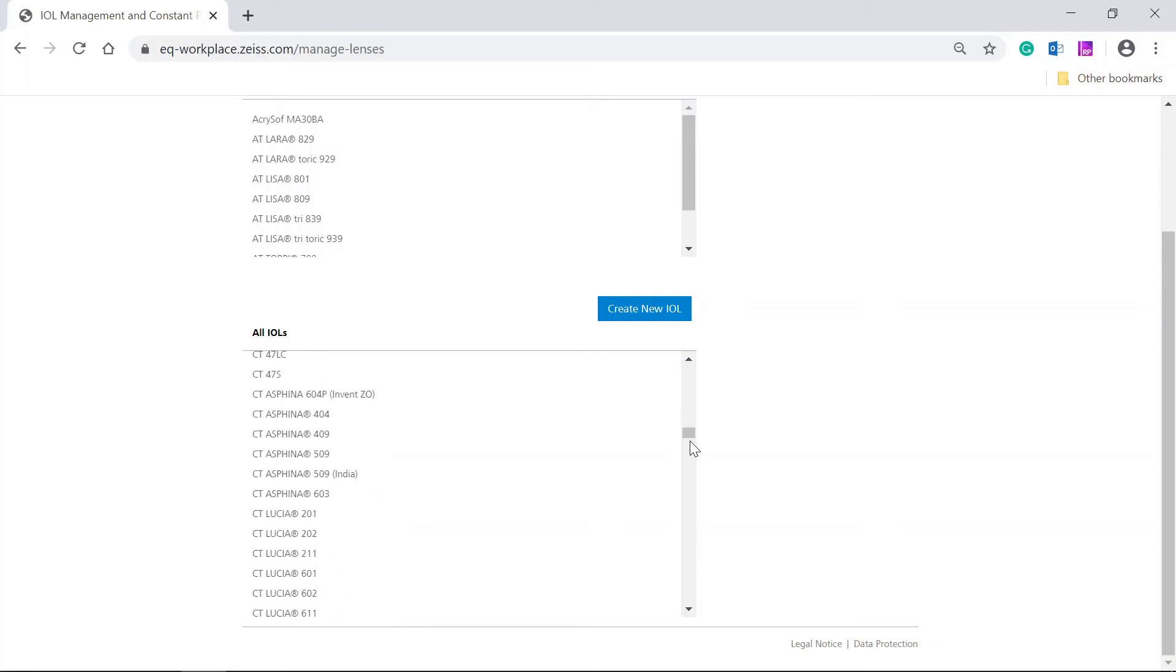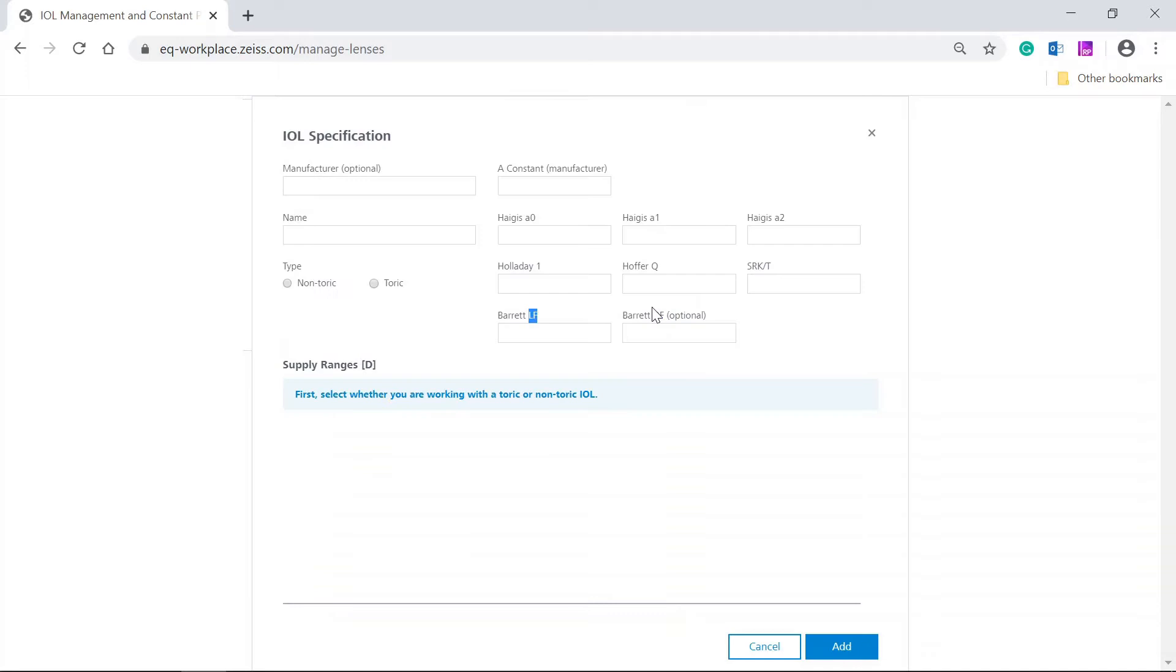Now click on the Create New IOL button. A new dialog window opens with the input fields for the values of the IOL to be created.